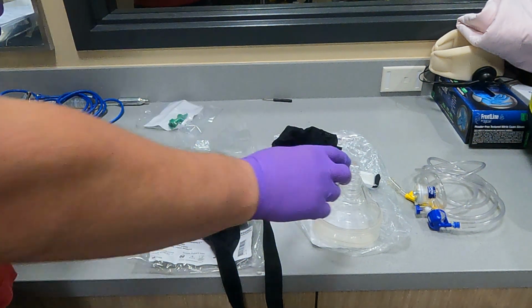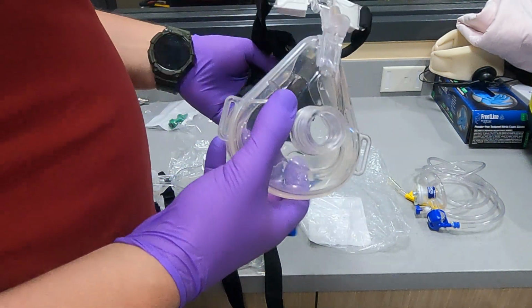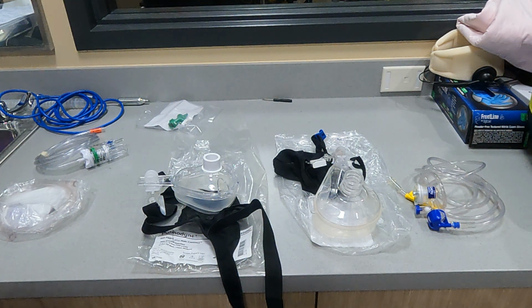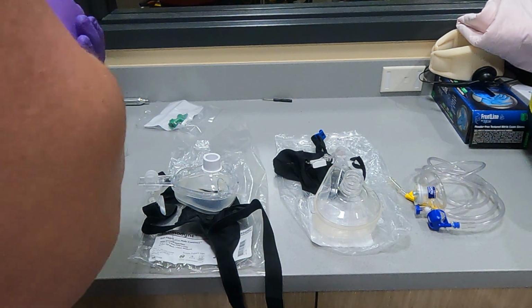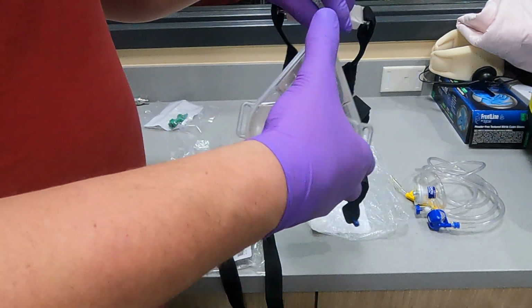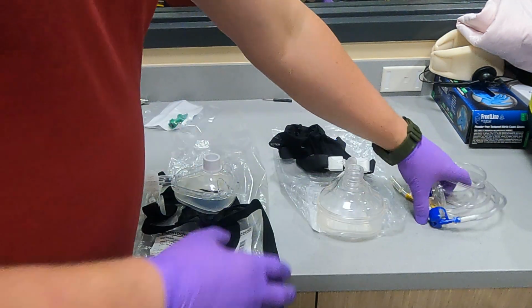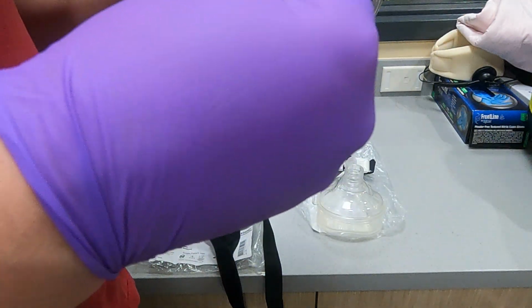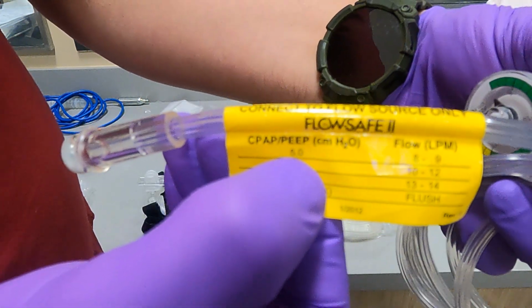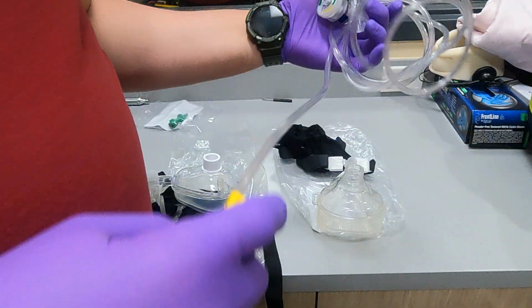So I have assessed our patient and determined that a large adult mask would be the perfect size for him. So we are going to get this set up. The first thing we're going to do is drop this all the way down, make sure it's ready. I want to give my patient a PEEP of 5. So on here, PEEP of 5 is 8 to 9 liters per minute of oxygen.